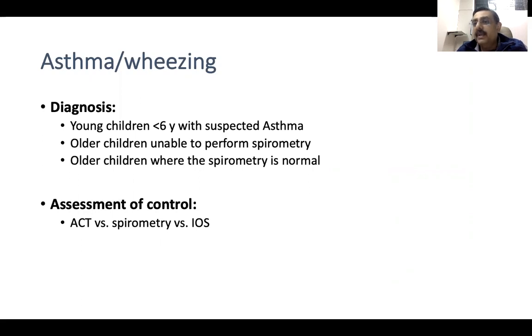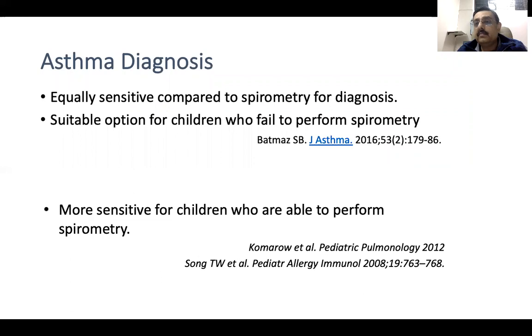We might be doing it for all patients, but that is not what I'm trying to recommend. It is something of our personal practice, because we have the equipment available at our clinic and hospital at both places, and our practice is exclusively respiratory and allergy. It is a useful modality to assess the level of control. Oscillometry has been found to be equally sensitive compared to spirometry for diagnosis. But as I said, there are caveats, as we have talked about. It is a good option where children are not able to perform a spirometry.